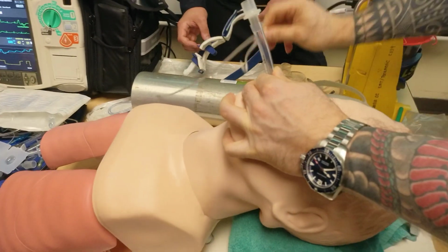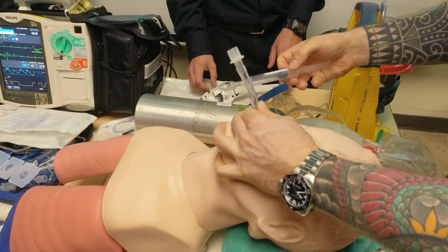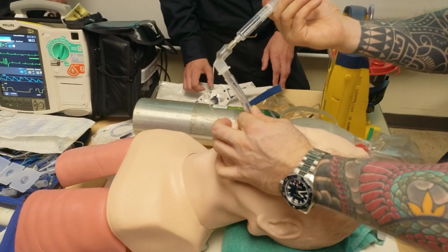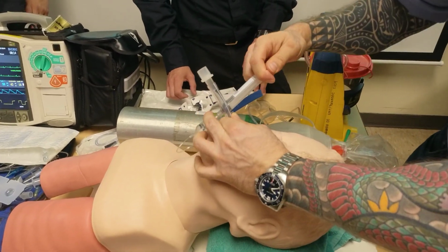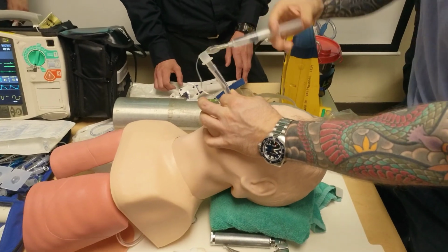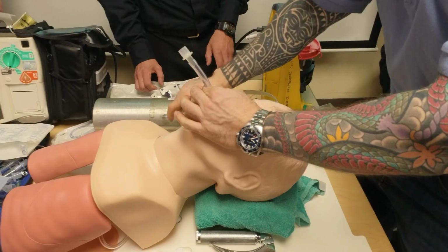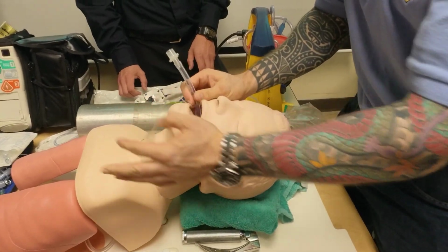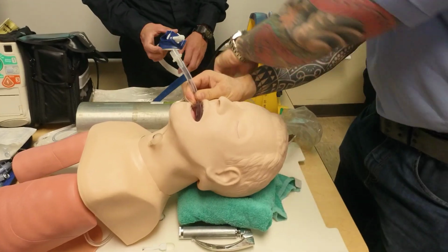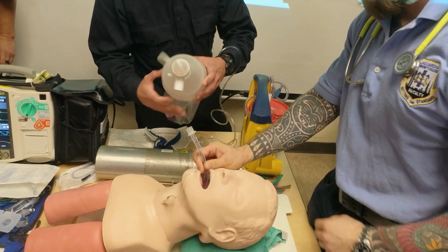So I take this out, and then I connect my end-tidal. This is a very important step of the procedure. When I inflate this, I want to make sure I disconnect it right away. I don't let it go. This is a critical failure. Why? You see how the air went back? So once you inflate, you bring it to your finger and you do this. At this point, I'm locked in. My hand doesn't move until this is secured. So before we secure it, my partner here has to confirm. How do we confirm?